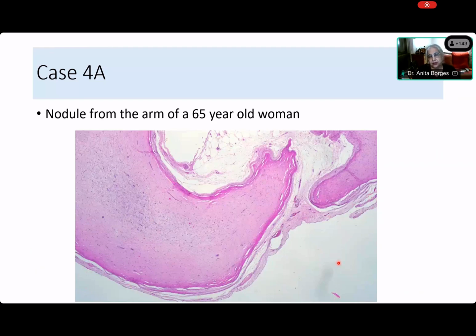You said that this is well encapsulated. It could be a nerve sheath, ma'am. What are you saying about this tumor? Do you think that this is in continuity with that? Obviously, the tissue is in continuity, right? So what do you mean by well encapsulated?